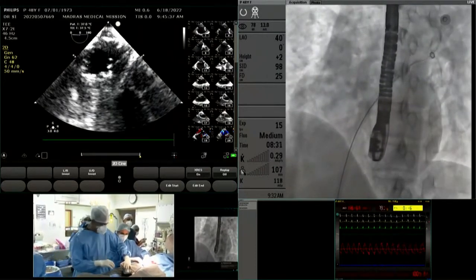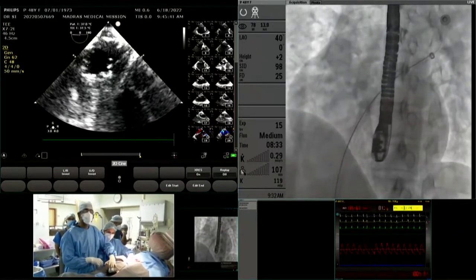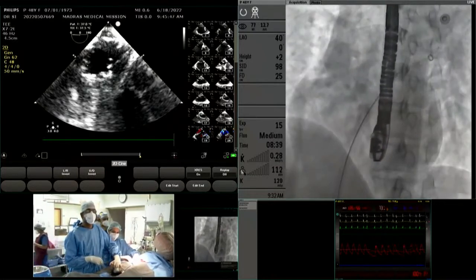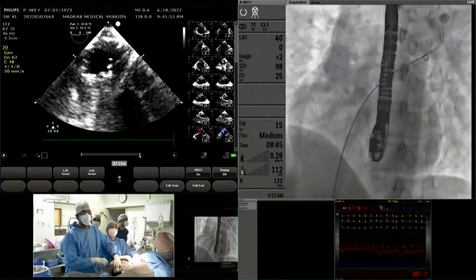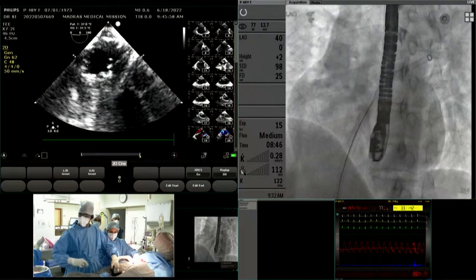Another question, sir, since he is 48 years, are you planning to take LVEDP baseline as well as post procedure or not? And coronary angio, these two things, sir. We will do it. RA pressure was quite low, so I assume LA pressure is also low, and so the LVEDP will be low. I have an arterial line. Once I get my devices across, then I will be checking the EDP. Sister, wire out, sister.